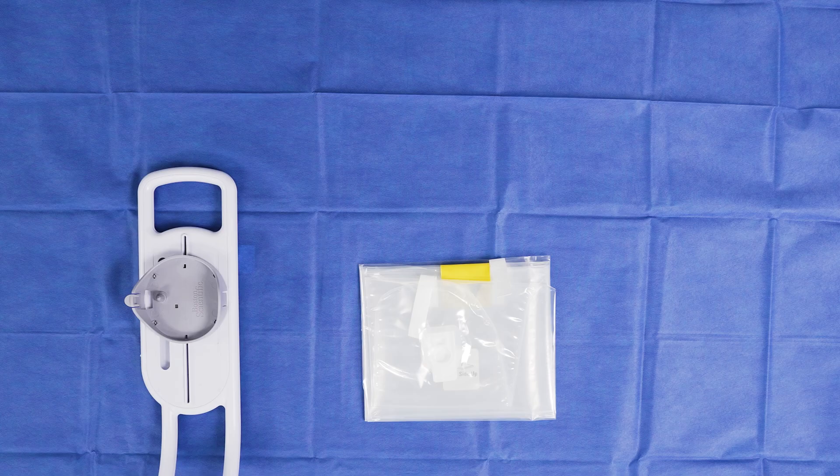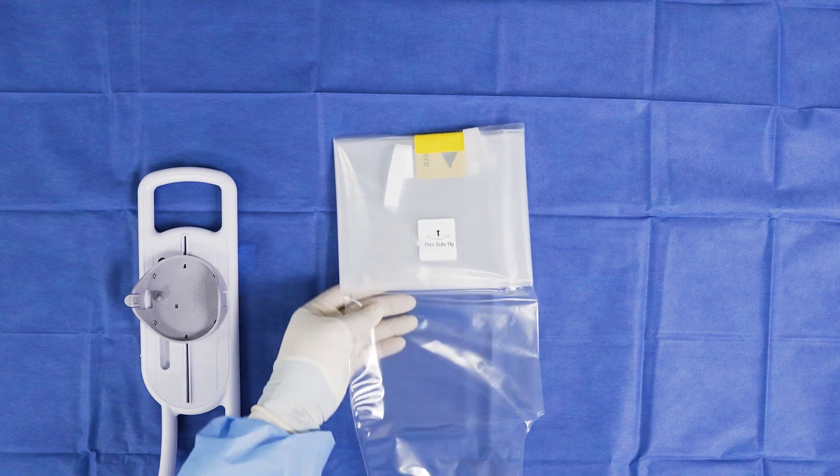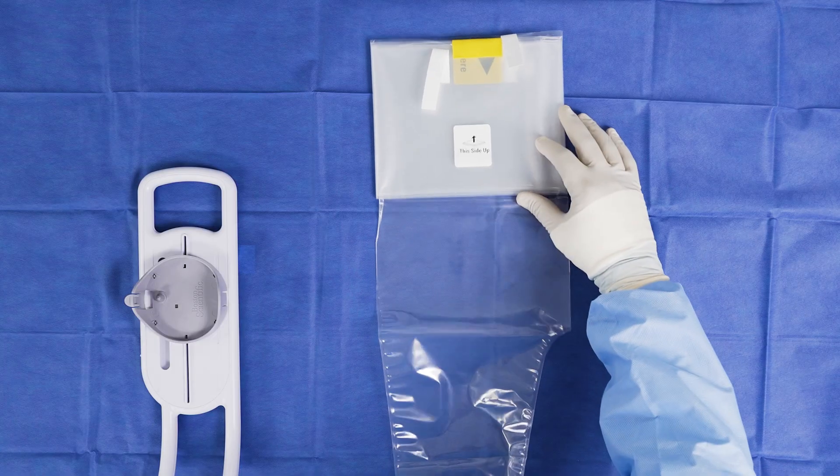Start by placing the sterile bag over the motor drive unit, also known as the MDU. This step requires a sterile and non-sterile operator. The non-sterile operator opens the pouch containing the bag, and using sterile techniques, the sterile operator grabs the bag from the pouch and unfolds it, ensuring the 'this side up' sticker is facing upwards.